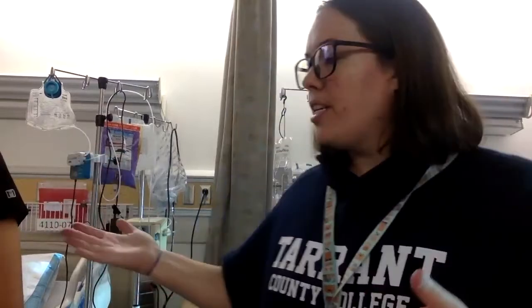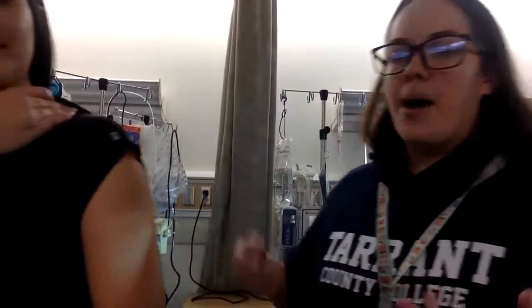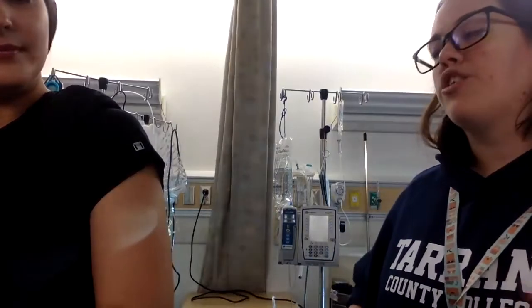So now I have my drawn up medication. I'm going to go into the patient's room, or if I'm already there, I'm obviously there. And then I'm going to identify some sub-Q tissue. So sub-Q tissue, if you'll come closer. And so I have some sub-Q tissue here, and I would just find a place with some sub-Q tissue. And there's a good spot here. And I say, hey, I need to give you an injection for your insulin. Here was your blood sugar.